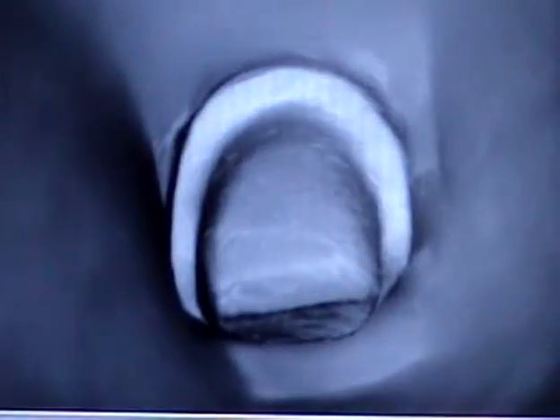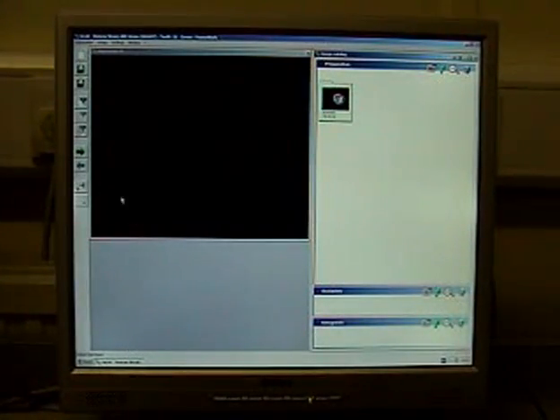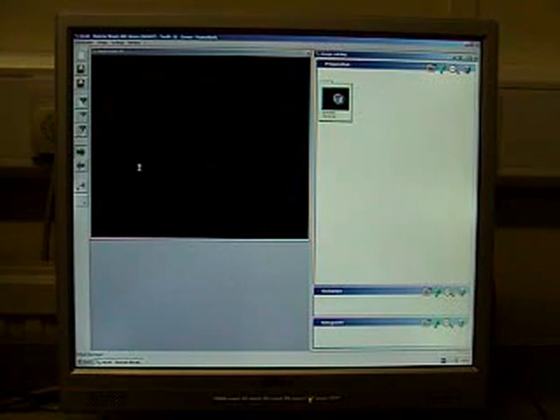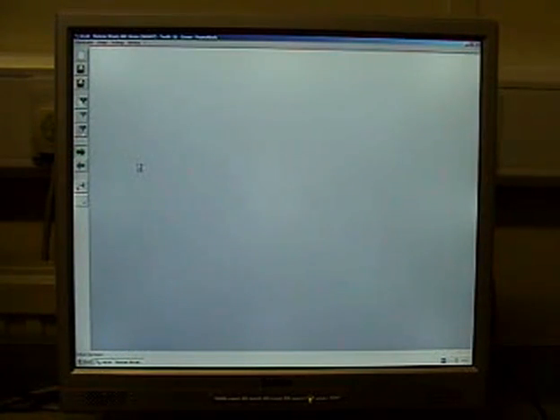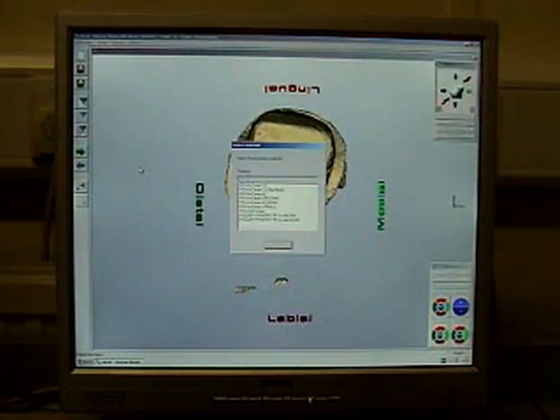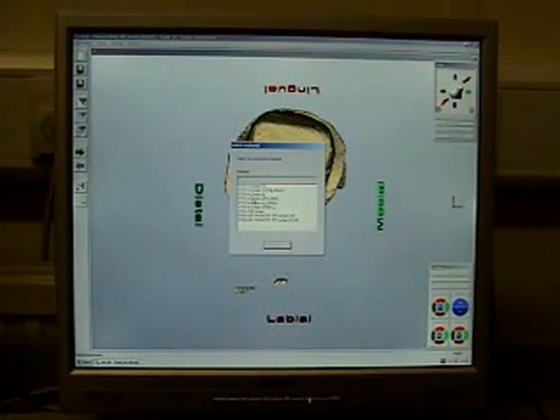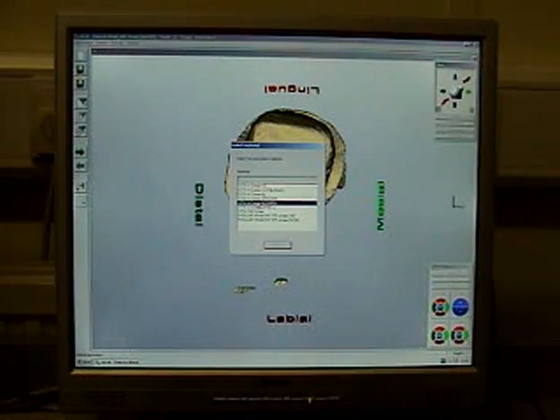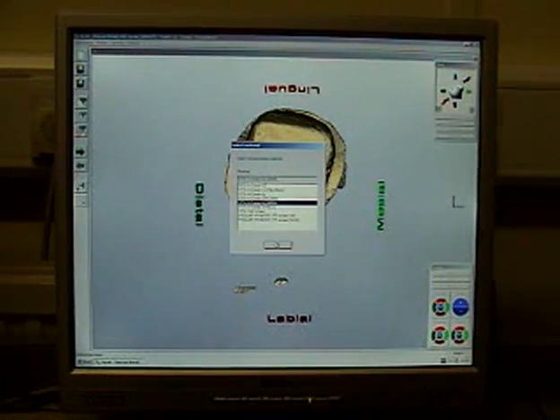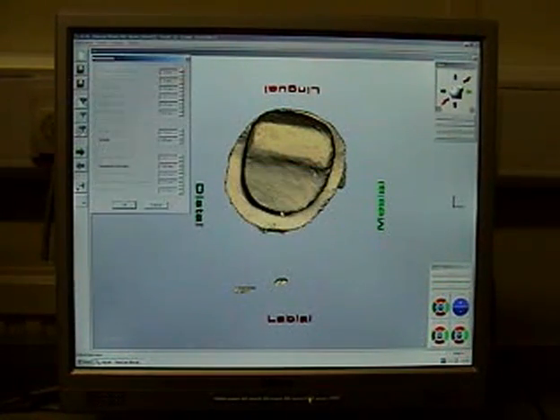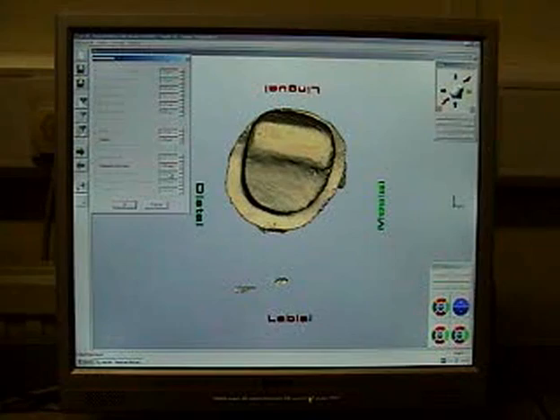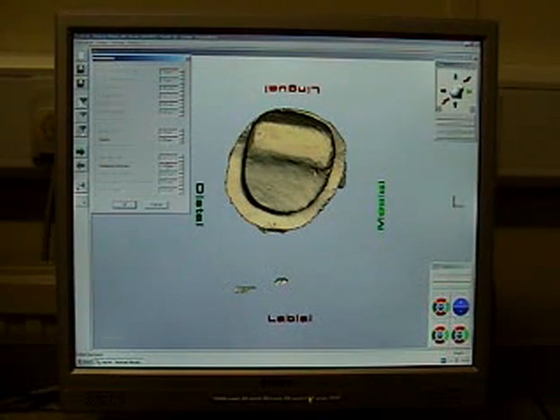So this is just one of the scanning processes. It's the most accurate because it takes pictures all the way around as opposed to just a top view image. So the computer is rendering the three-dimensional version of the preparation. And we're picking the material that we intend to make the coping from at the end of the process. Although you are allowed to change your mind.